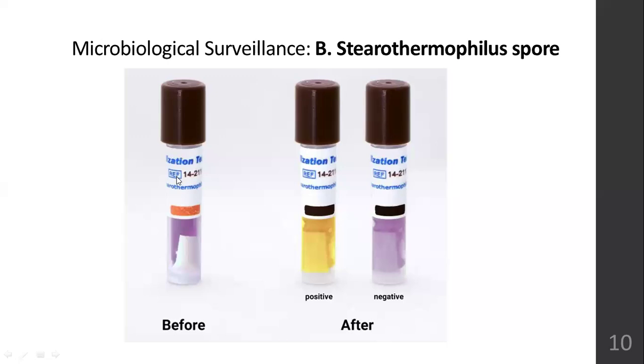You say the sterilizer has a passing result when it is effectively killing a large number of highly resistant bacterial spores. When your autoclave, ethylene oxide chamber or hydrogen peroxide gas is able to kill resistant bacterial spores, that's when you can say this is a quality assured sterilization technique. That's the importance of using these biological indicators.